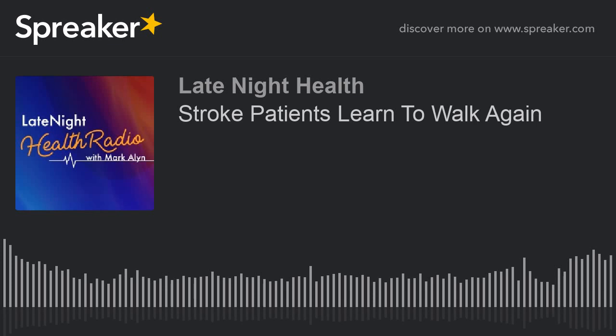What's the primary goal of using the EksoGT? Well, it's based on the concept of neuroplasticity. So for our patients, we're trying to not just strengthen their muscles, but also retrain their brain. And research shows that increasing the number of repetitions, or with Ekso, the number of steps taken, actually helps improve that neuroplasticity and helps retrain the patient the best patterns of movement, get them used to being upright again, kind of everything that's great for the body.